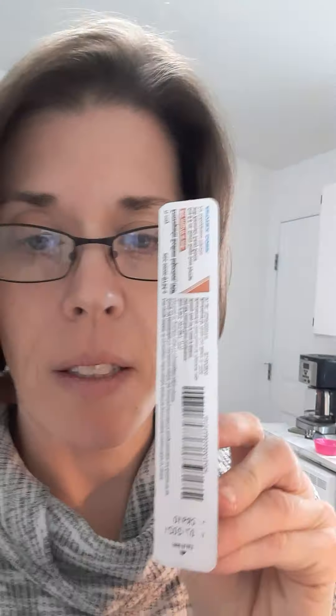Hey everybody, I just wanted to put you through what I go through starting today. I've had to do these before — Lovenox injections. I'm not brave enough to do it myself, so my husband's going to do it. We have all the supplies. This to sanitize, and it goes in the stomach, just right up under the skin. I had to stop my warfarin to do this until I have a procedure done on Friday.